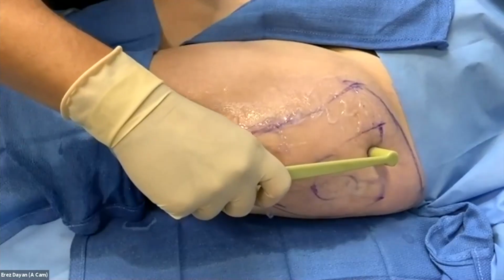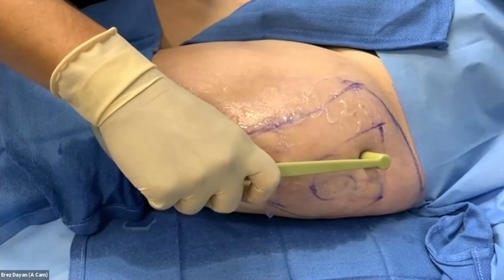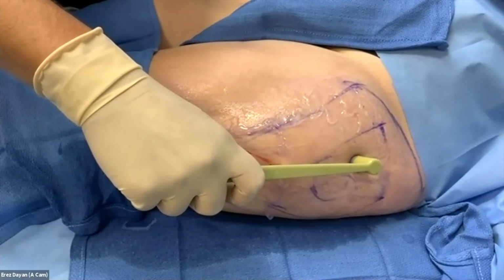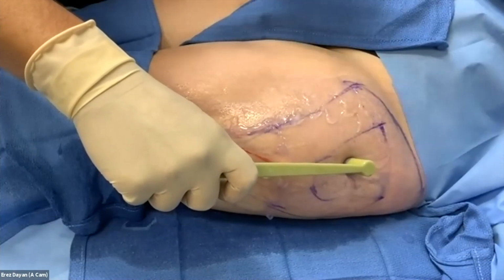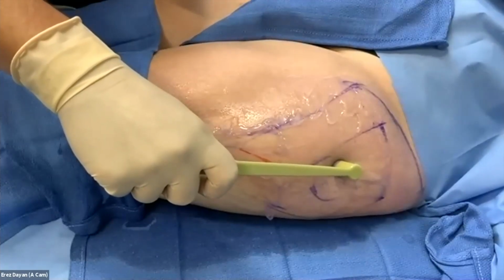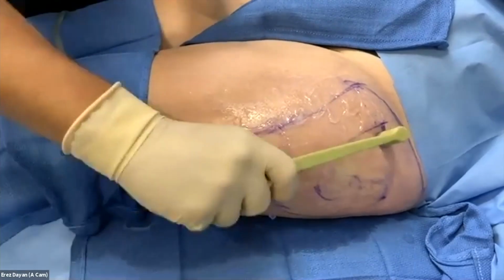Cellulite is a good question. How about there? Good, okay. Cellulite's a good question. I do think that this technology definitely remodels fat. Cellulite, I think, is a complex combination of issues. You get the fibroseptal networks pulling down on the skin. There's some fat contour issues. So I think it'll remodel fat for sure. Not really melt fat, but just remodel the surface of it, and also tighten the fibroseptal network. So I've seen cellulite improve significantly with radio frequency. It's just not always reliable. So I'll tell patients, well, your cellulite will probably get better. It definitely won't get worse. But I wouldn't oversell it.